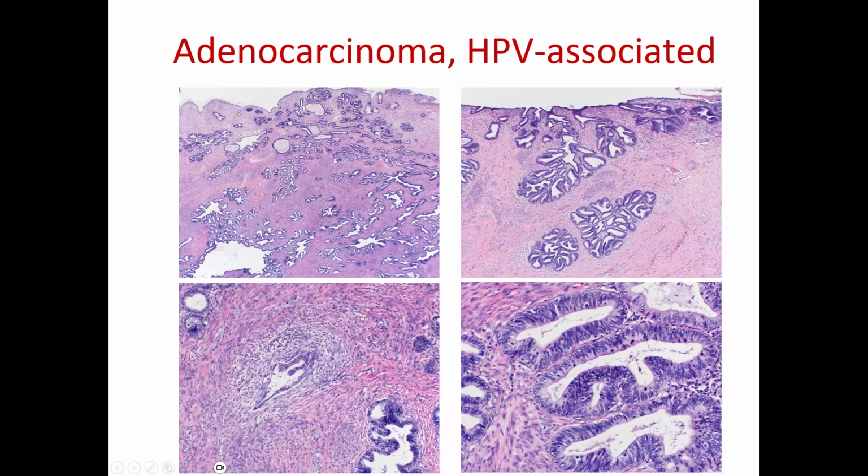If the lesion is very tiny and less than 3 millimeters, it's going to be like 1 millimeter or so. Then again, a lesion like this, if it is 2 millimeters, whether you measure from here or from here, it doesn't matter. It's a tiny lesion, less than 3 millimeters, and probably the patient is not going to get lymphadenectomy.